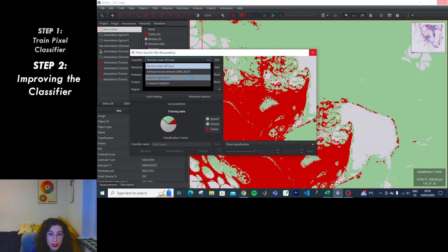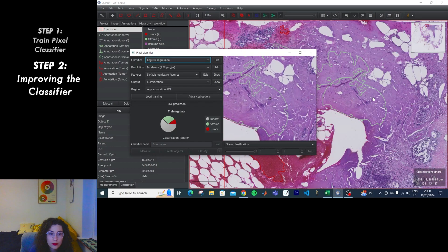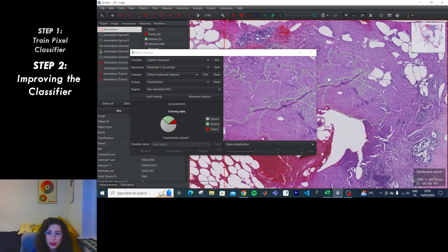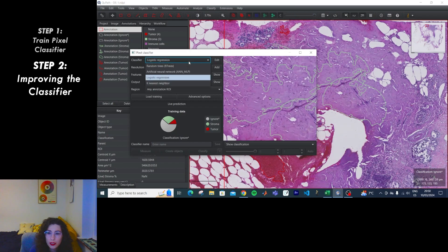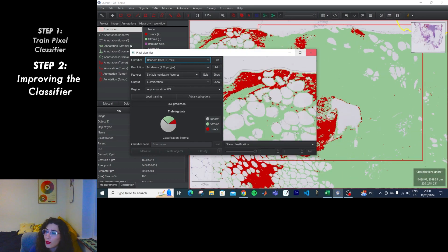Logistic regression does take a long time and doesn't work well. Now running Random Trees — yeah, okay.